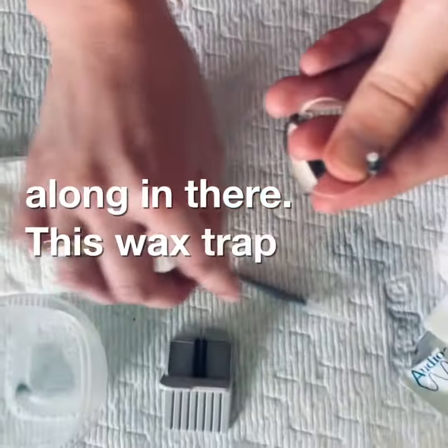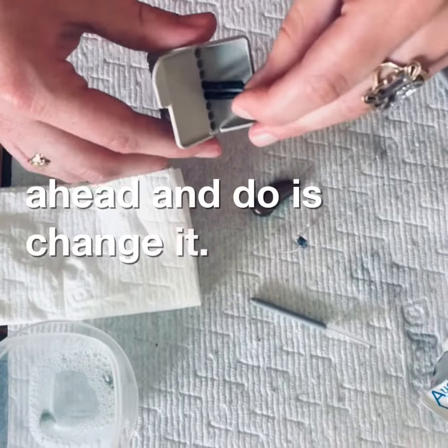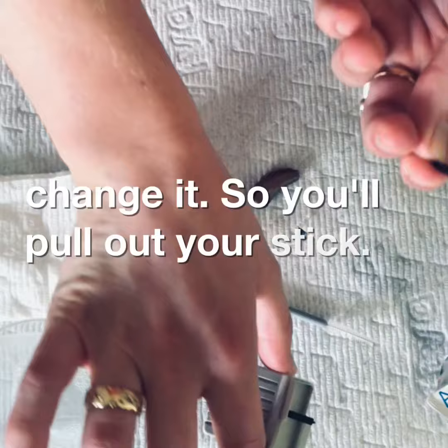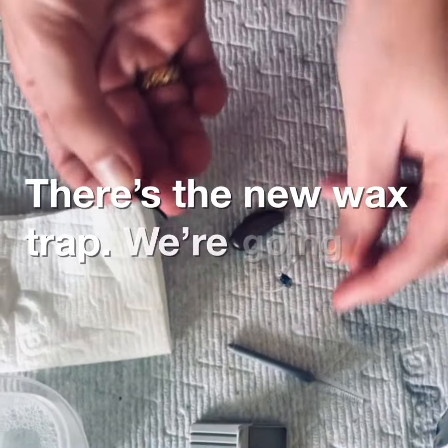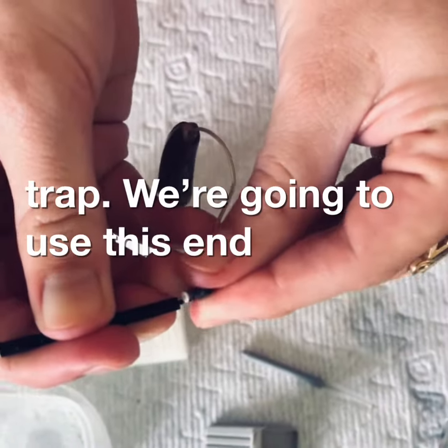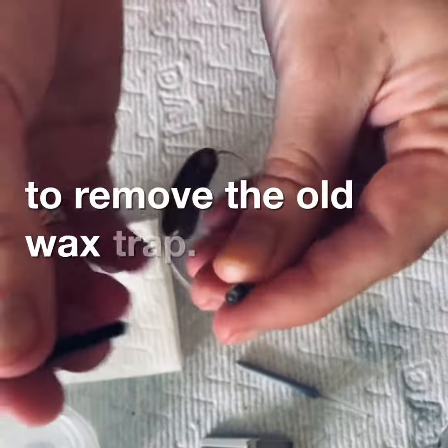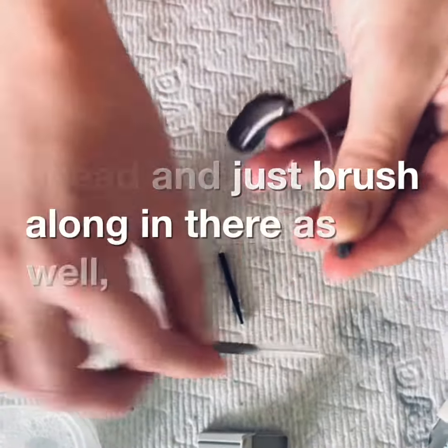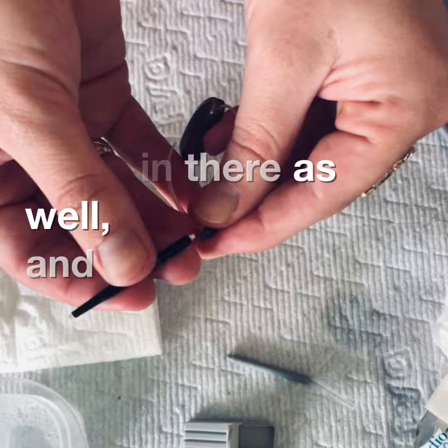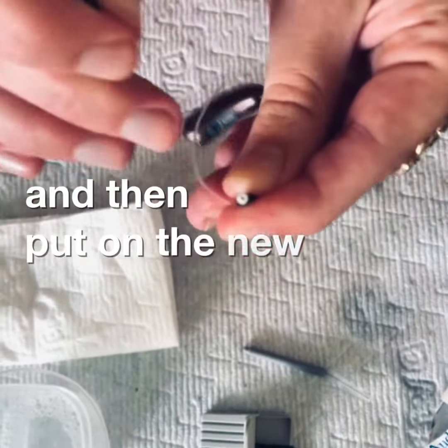You can also check your wax trap and brush along in there. This wax trap is a little clogged, so we're going to go ahead and change it. Pull out your stick — there's the new wax trap. Use this end to remove the old wax trap. While that's off, brush along in there as well, then put on the new wax trap.